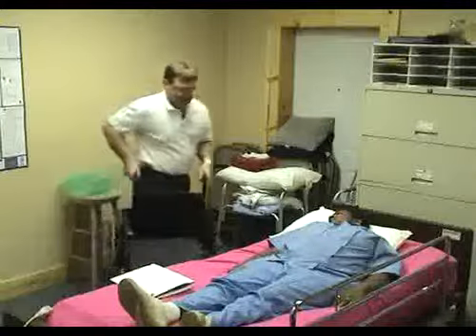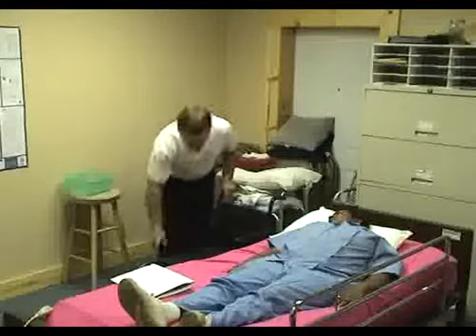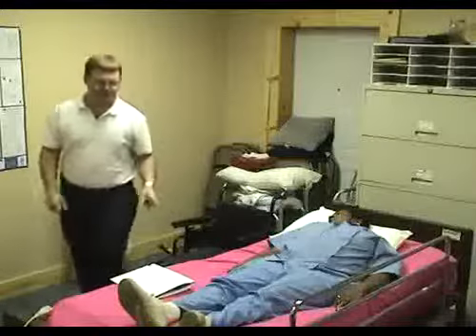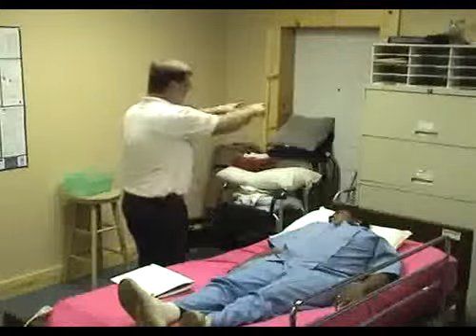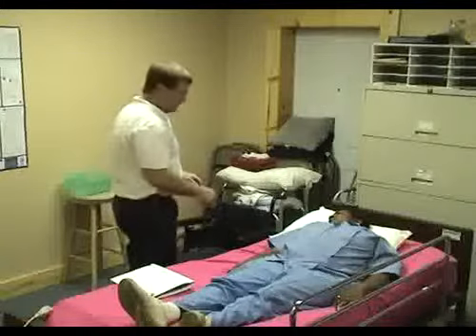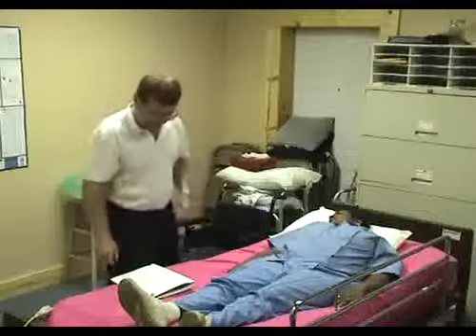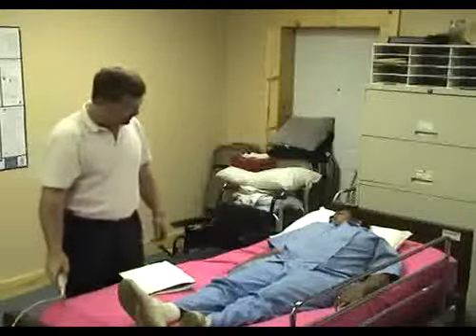Okay, so you position it, and then it says secure it. How do you secure it? Lock these wheels every time, because when you don't, and you got to get the person up, as soon as their legs touch it, it's going to go backwards, and then the patient's going to go down on the floor instead of in the chair where you want them. Okay, that's number 1. We got the wheelchair in the right position.